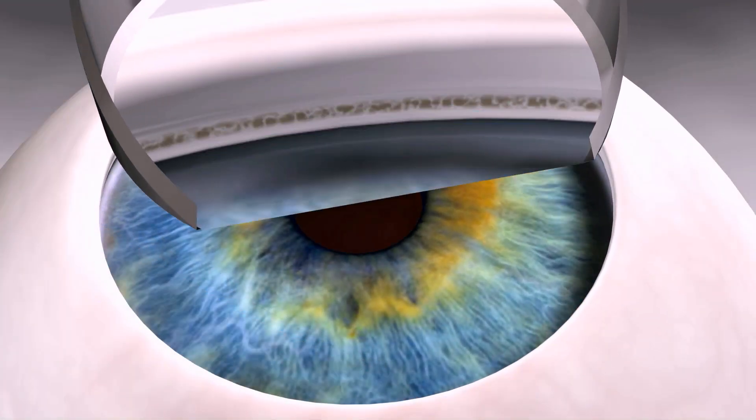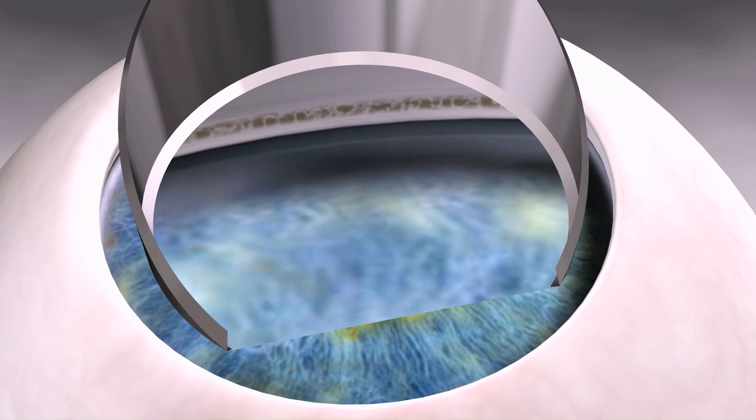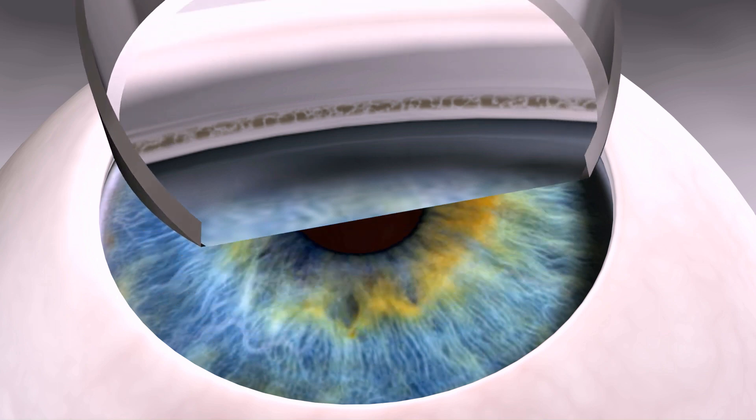After prepping the patient, gonioscopy is used to confirm adequacy of the angle for device implantation prior to insertion of the Cypass Microstent.